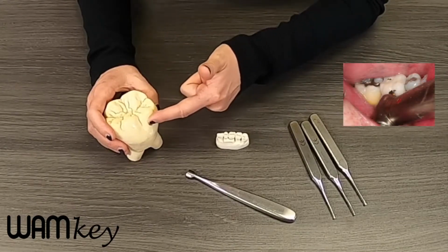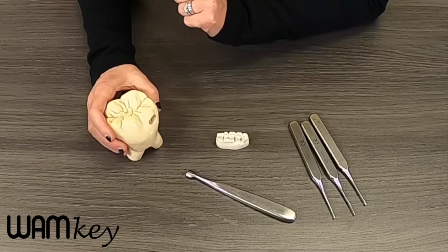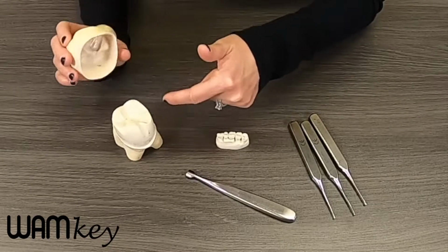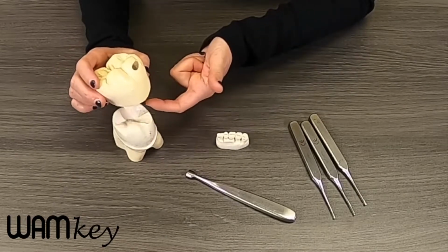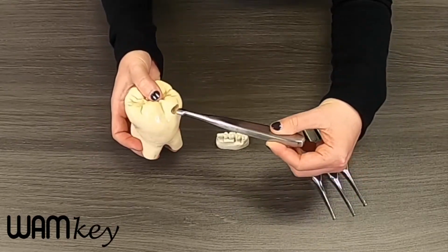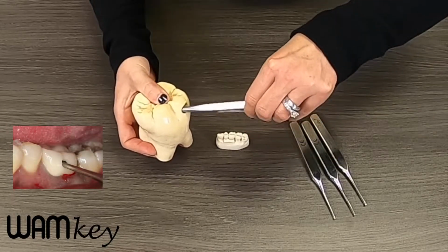So you'll make your small opening, look in, and see if you can see the cement junction. If you can see that, then use the underside of the crown as a guide, and you want to drill all the way into the center of that prep. It's very important to get into the center of this prep because that's where you get your greatest force to push the crown off. This is a very large demonstration model, so you can kind of see, but basically you insert the key and you twist with this.